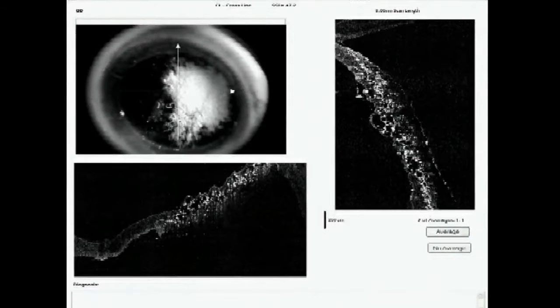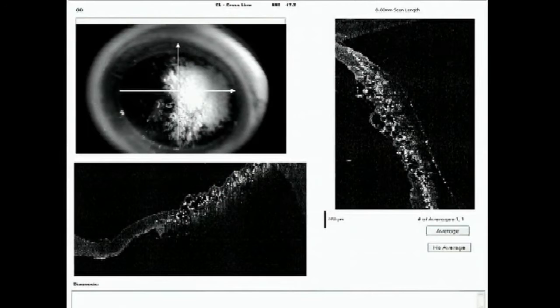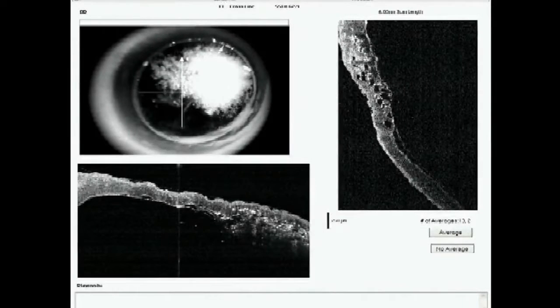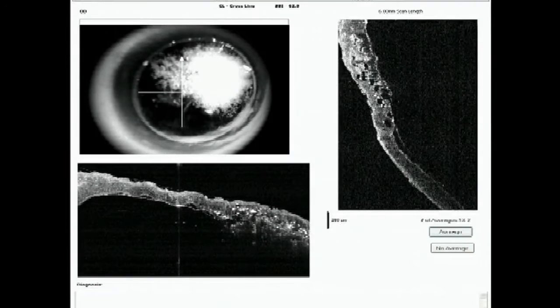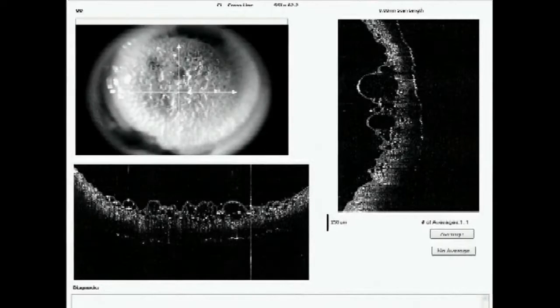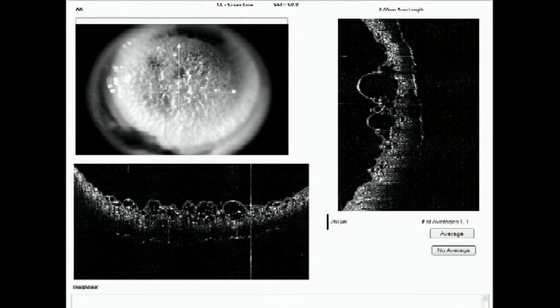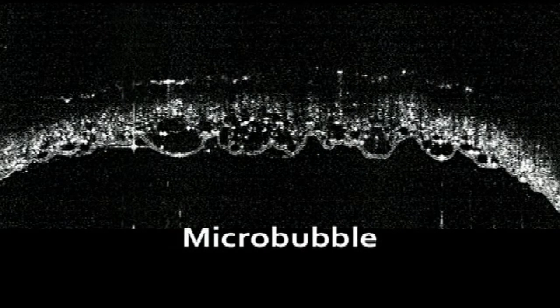With the help of anterior segment OCT, we tried to understand the size, extent, and location of these microbubbles. Some bubbles are very close to the Descemet membrane, and some have already separated the Descemet by reaching the junction of stroma and Descemet. The question was: can these microbubbles be converted into a bigger one?